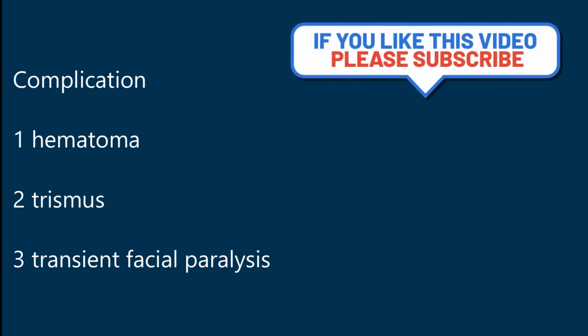Complications. 1. Hematoma. 2. Trismus. 3. Transient facial paralysis.